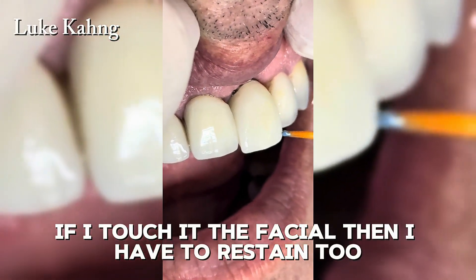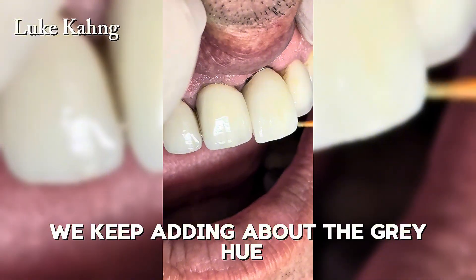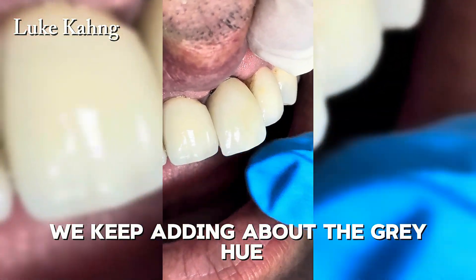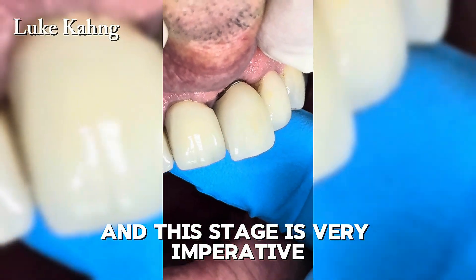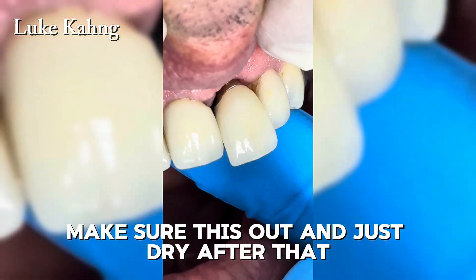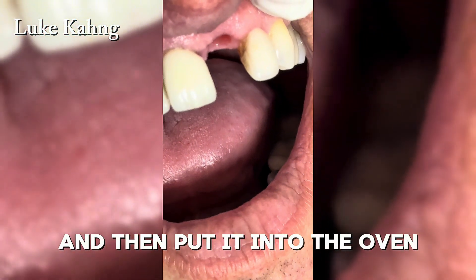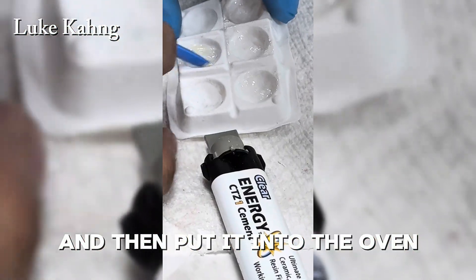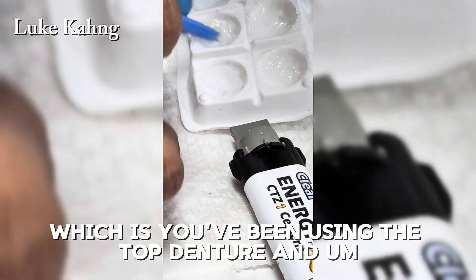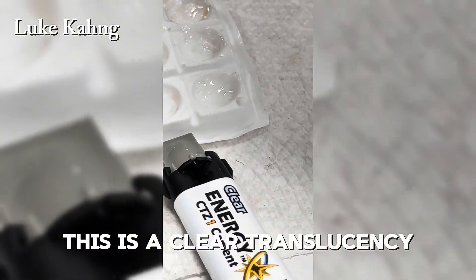It is really important to be careful taking the restoration out of the patient's mouth — if I touch the facial surface, I have to restain it. We keep adding gray hue at the incisal one-third. This step is very important. I do not put it all the way down; I make sure it is out, dry it, and then put it into the oven.